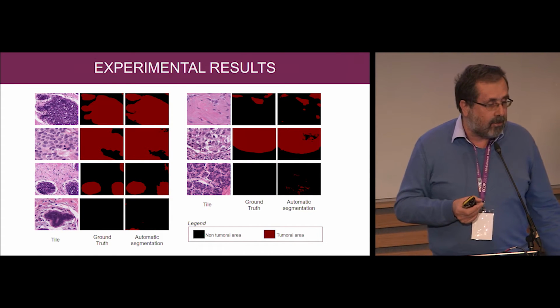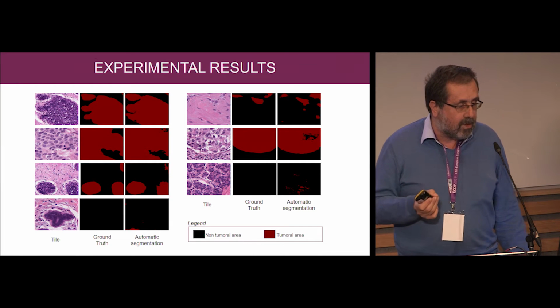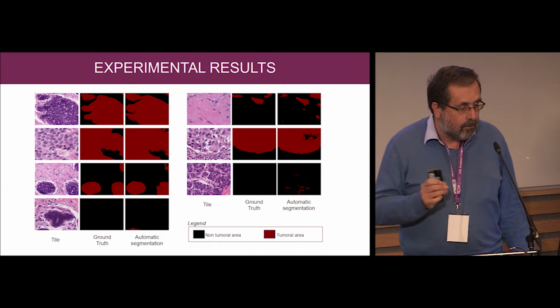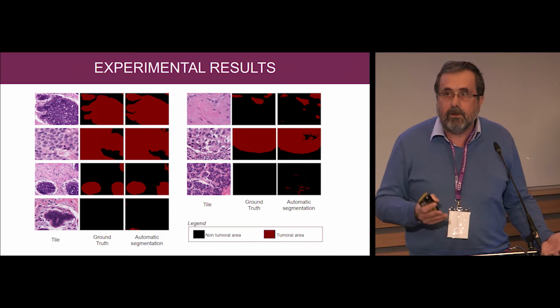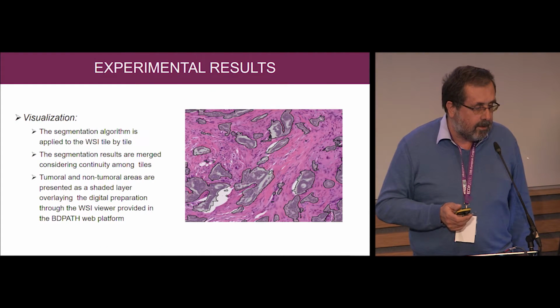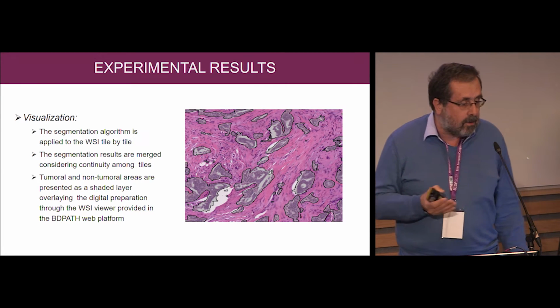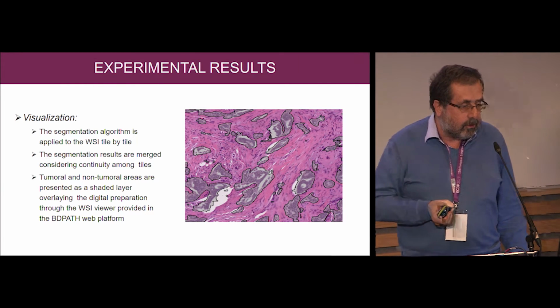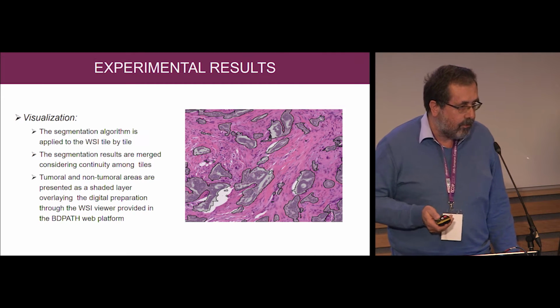These are some images showing how we are trying to separate benign from tumoral areas, how we are trying to separate infiltrating lobular carcinoma from ductal infiltrating carcinoma, and how the system is behaving really well, also trying to do this work for us. And this is the result that we obtain. After you run the algorithm, the system is able to locate where the areas of carcinoma are and the different types of carcinoma that it is able to find.